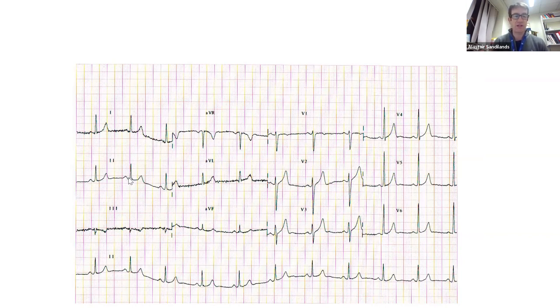We have a PR interval that's normal, okay? It's less than 5 small squares. We have a QRS that's narrow, less than 3 small squares. And we have a QT interval that is normal. I try to look at one where it's the start of the QRS, then go across to the end of the T. It's within 2 large squares, so we've got a normal QT interval.